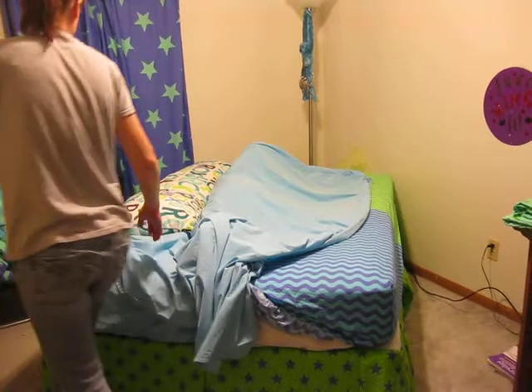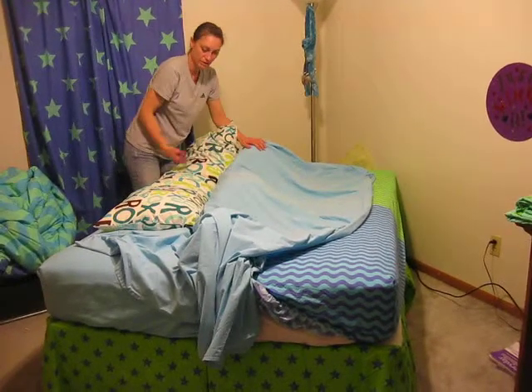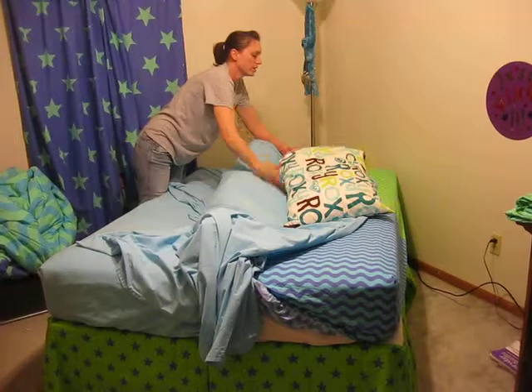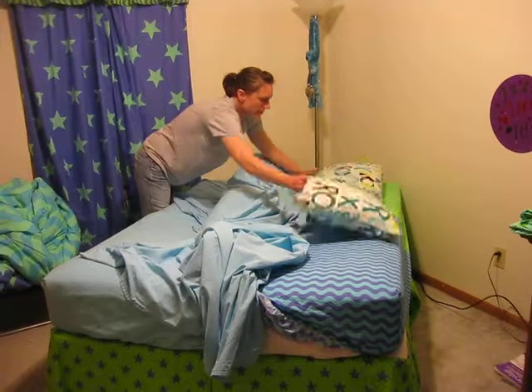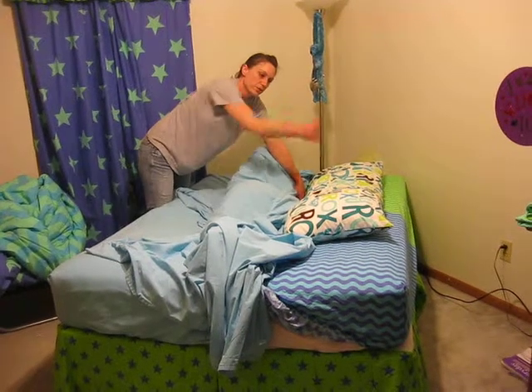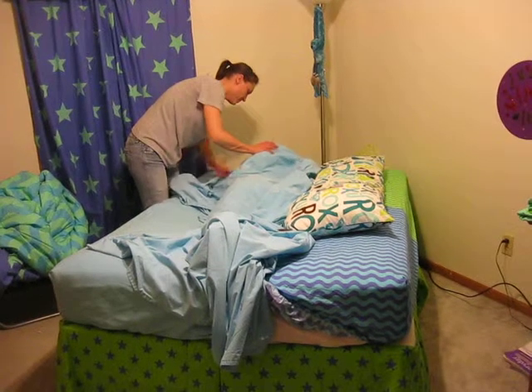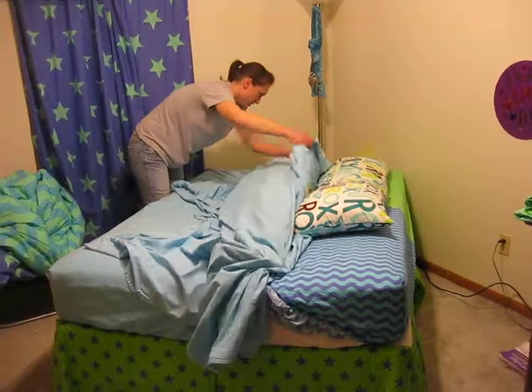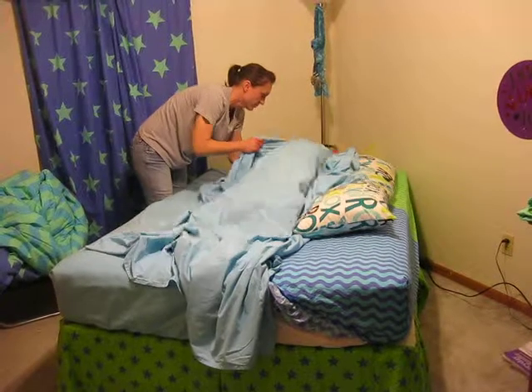Coming around to this side, since you're in front and they're towards you, they won't be able to roll off the bed itself. So you position the pillow back onto the other side, keeping this one here. And in hospital-type settings, you would have the railing where you drop one side and lift the other side. Having them roll back over to the other side, you then continue to roll them onto this pillow.